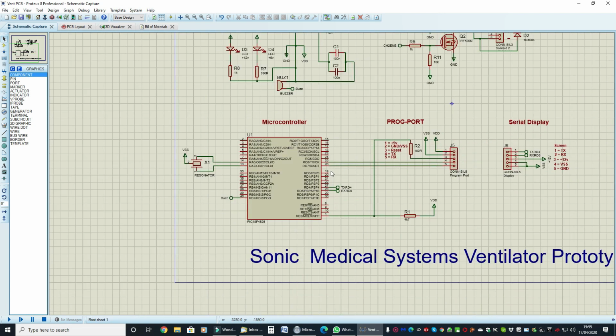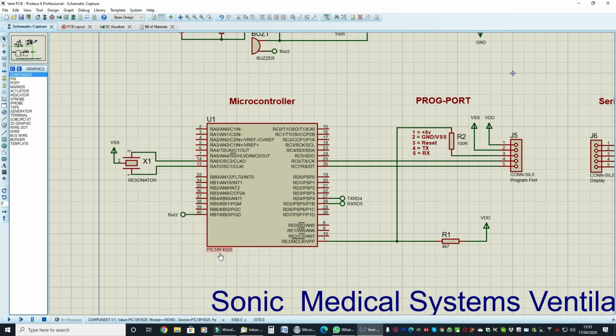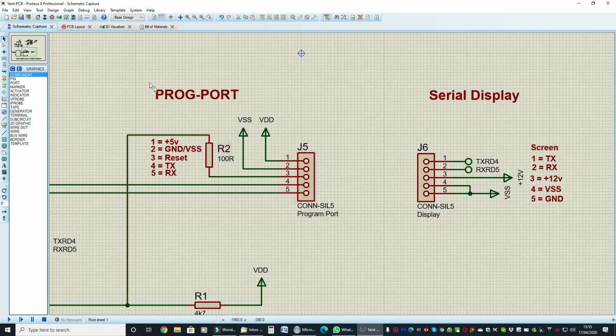Down here we're using a PIC18F4525 microcontroller, very reliable one. We have our 10 MHz resonator here, so this has internal and external clocking. Here we have our program port, which is for the integrated development environment, so we can do real-time coding or in-circuit coding and debugging.